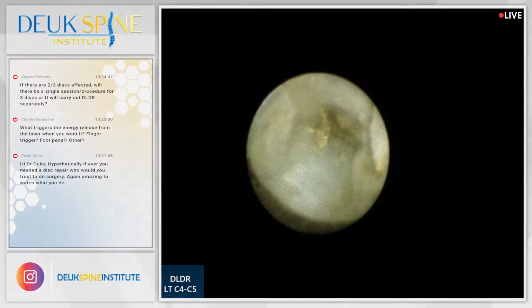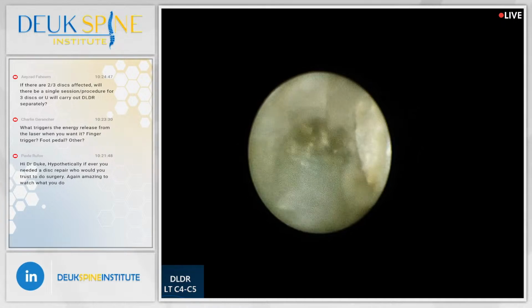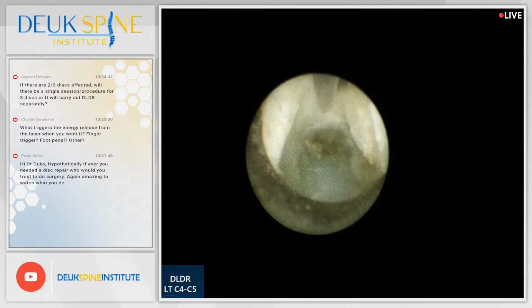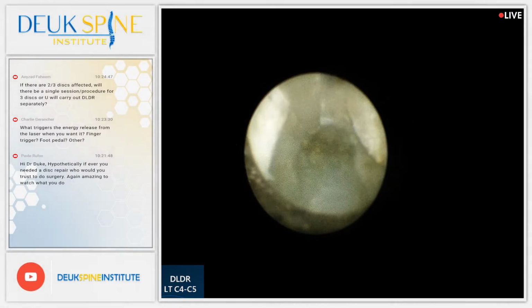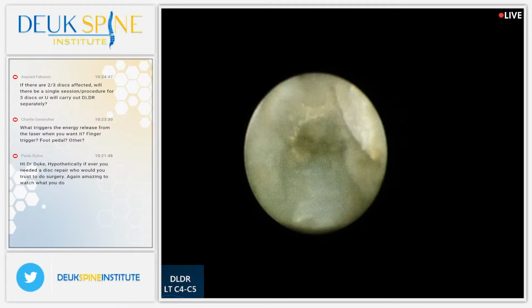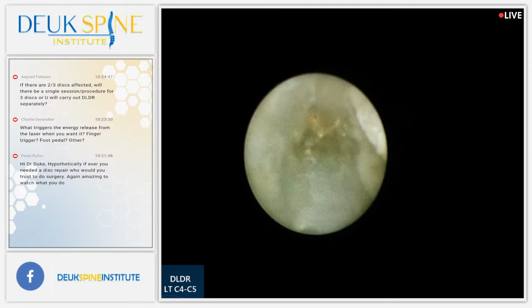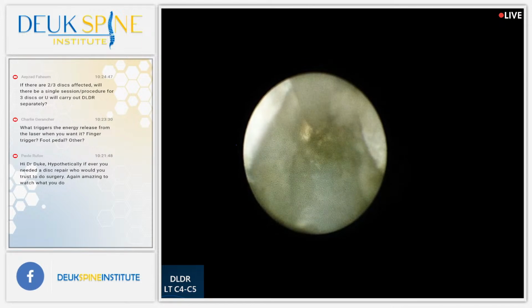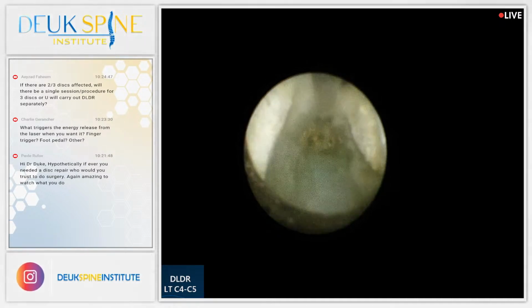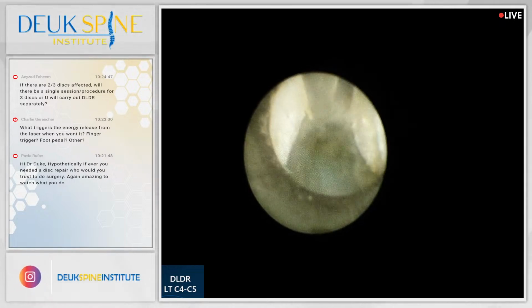Next question coming from Charlie, once more on YouTube. Asking, what triggers the energy release from the laser when you want it? Finger trigger, foot pedal, other? Yeah, Charlie, it's a foot pedal. My right foot is stepping on a pedal right now, turning on the laser. It's a foot pedal. Great question. Never talked about that before. Yep. This laser has a foot pedal, so the surgeon can actually push on the foot pedal and turn on the laser.